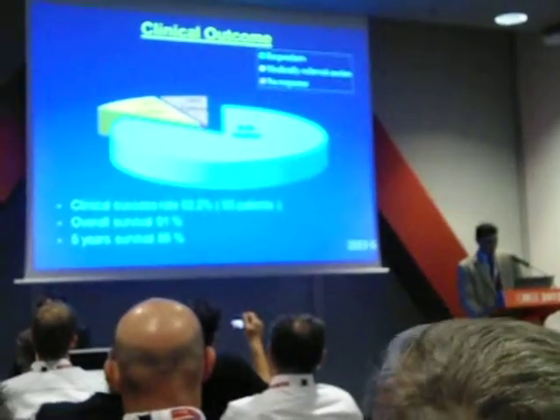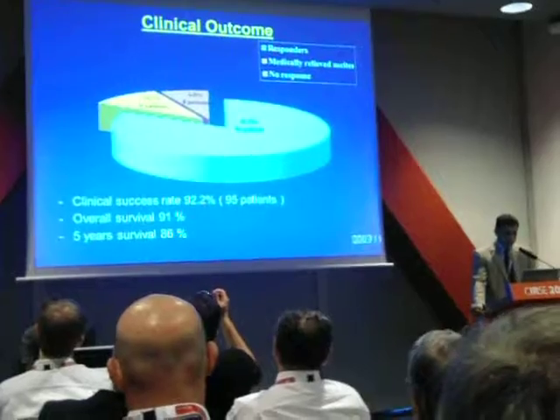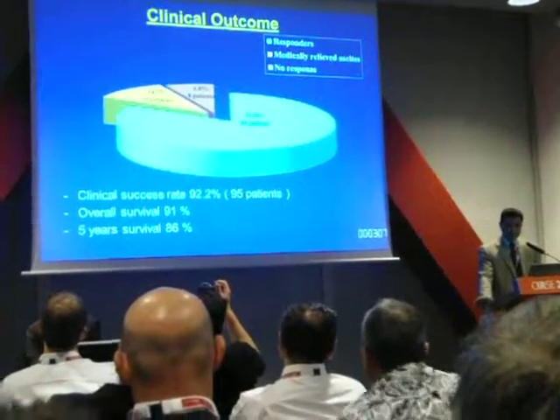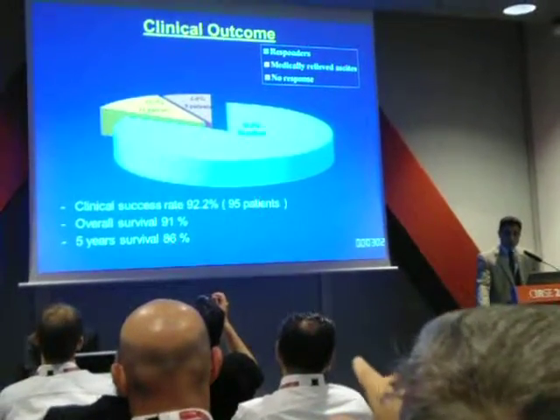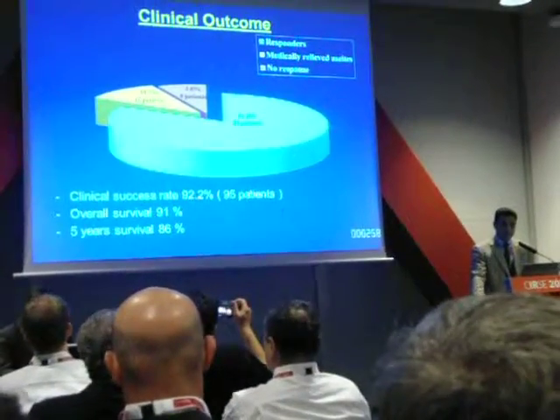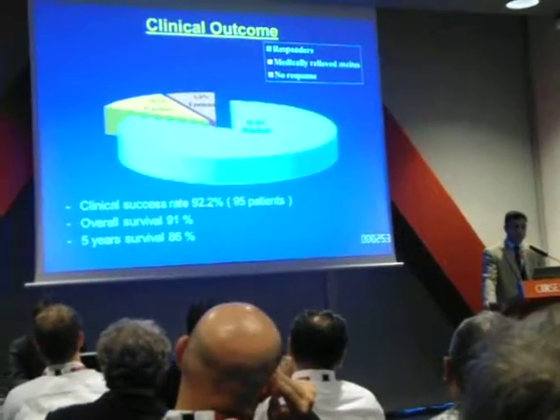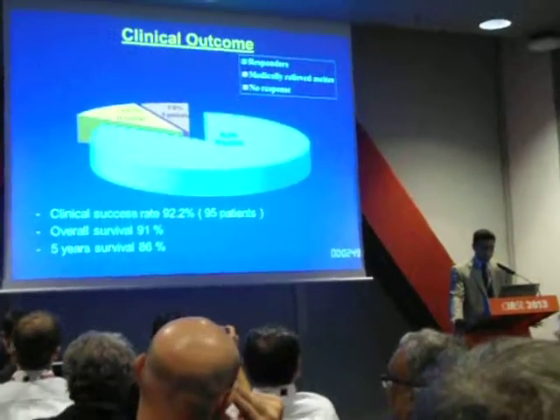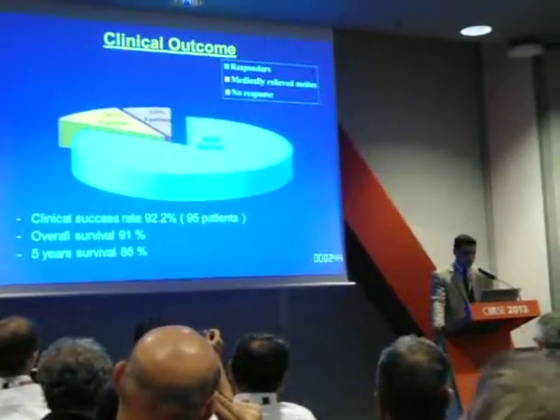at 1 year. Concerning the clinical outcome, 84 patients showed excellent response to the TIPS procedure concerning regression of the varices, stoppage of bleeding, and disappearance of ascites without any medication. 11 patients presented before the procedure with refractory ascites not responding to the maximum dose of diuretics. However, after the procedure, the ascites disappeared on a regular dose of diuretics and the patients were satisfied, so we considered them as successful cases. Only 8 patients didn't respond to the TIPS technique and were referred for liver transplantation.